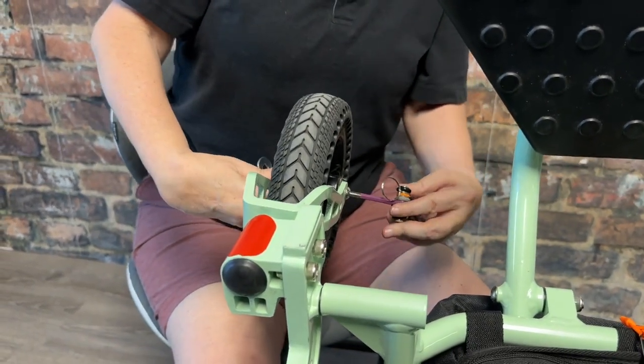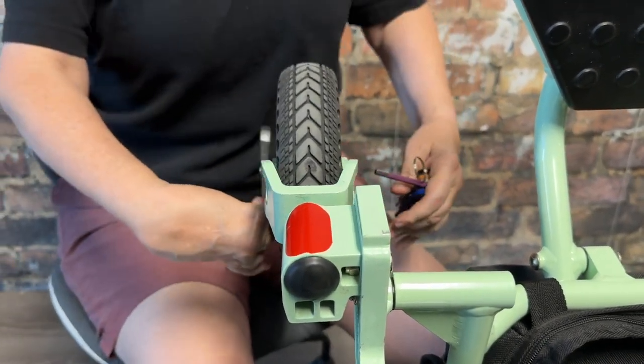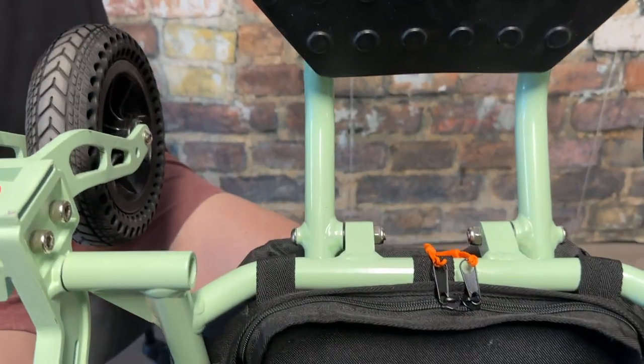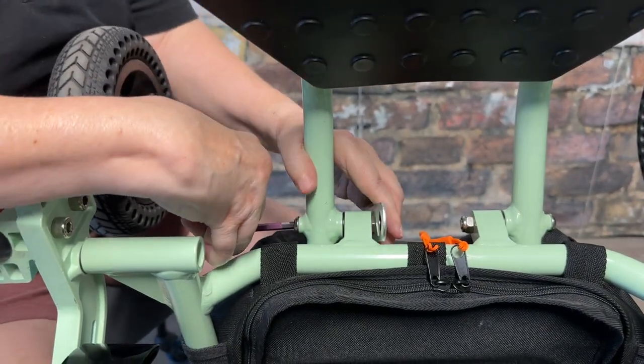Next we're going to move to the other side of the chair and start with the wheel again. Then we're going to move to the foot rest on the opposite side — use your makeshift wrench, again with the purple.